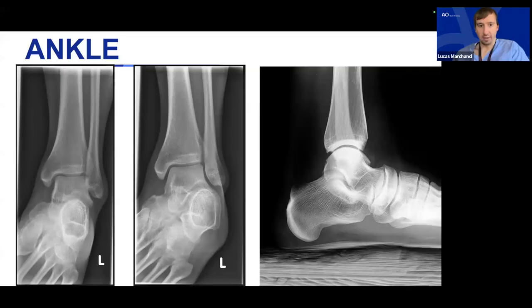But yeah, I feel very similar, that I really like looking at the medial gutter on the mortise, Pat, but I know what you're saying about the AP and the medial ankle structures. I think it honestly gives you maybe a little bit better look at the medial malleolus. Not necessarily the joint surface or the articulation between the shoulder of the medial dome of the talus, but it does give you a great look at the medial malleolus in general. And both views do certainly provide value, and it's necessary to understand the difference between the two views.